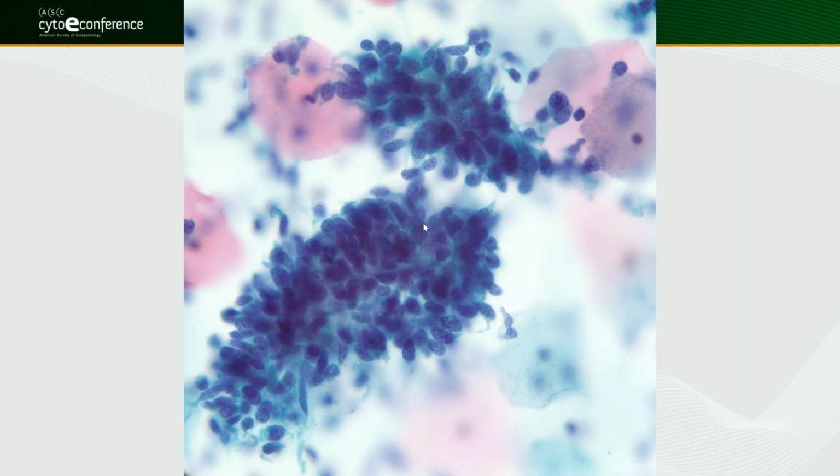And I think when it is at AIS stage, most people recognize it. It's more in the beginning, like is this just a reactive ECC? We call it atypical endocervical cells, NOS. That's when we need to really follow good criteria.